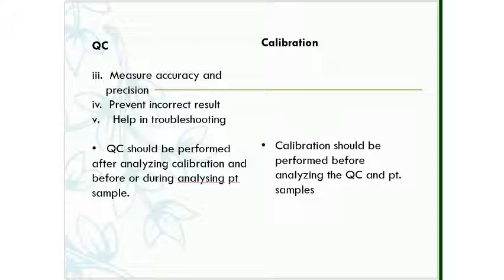For QC, it is to measure the accuracy and precision of the test, prevent incorrect result, and help in troubleshooting. And also, QC should be performed after analyzing calibration and before or during analyzing patient sample, while calibration should be performed before analyzing the QC and patient samples.